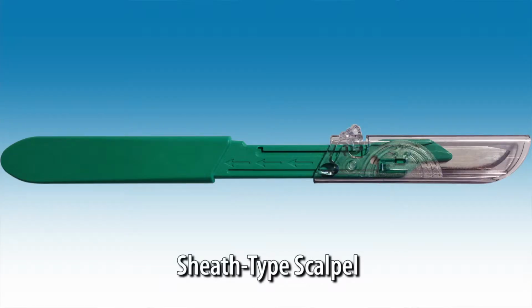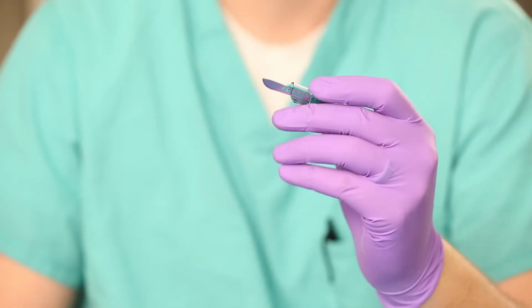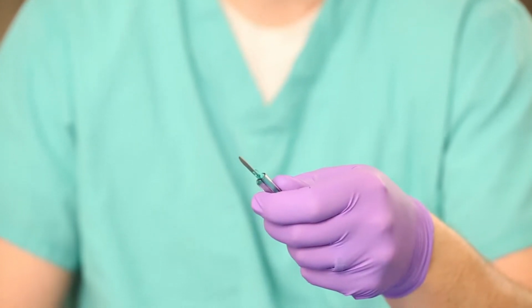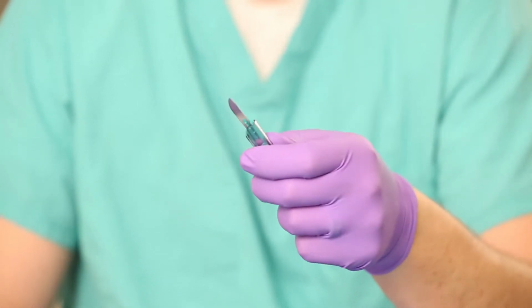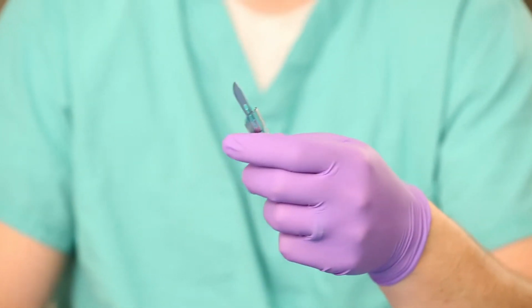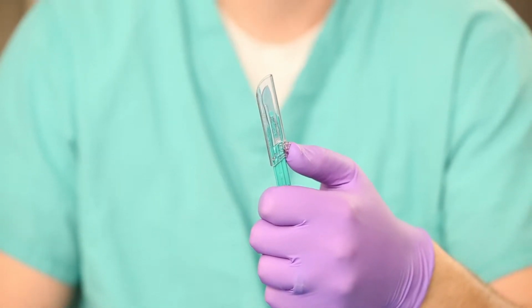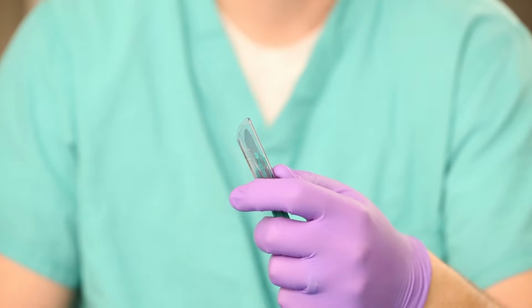This standard sheath type scalpel requires that the user retract a sheath that covers the blade using the thumb. When the user then wants to cut, either in a pen-like position or in a palm grip position, you'll notice that the fingers cover the protective sheath. So when it's time to retract the sheath and make the scalpel safe, the user has to reposition the hands.